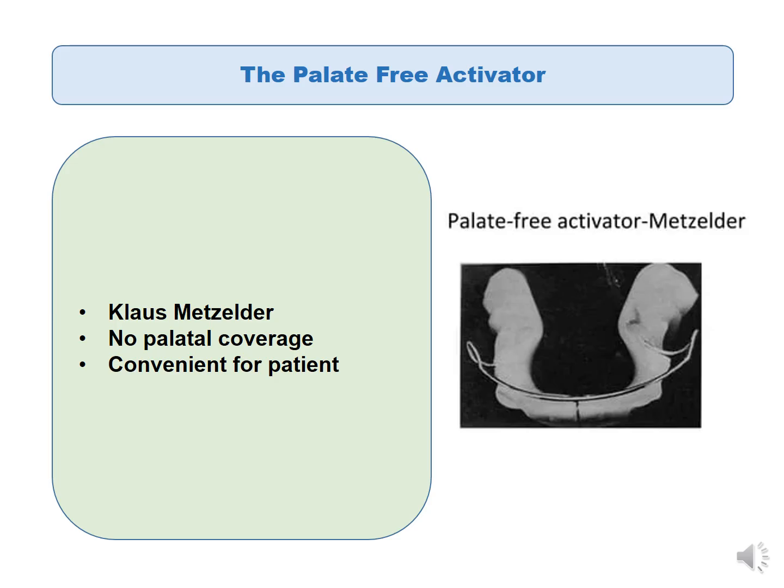Now the palate free activator, introduced by Metzelder, has no palatal coverage, and because there is no palatal coverage, this appliance is very convenient for the patient.